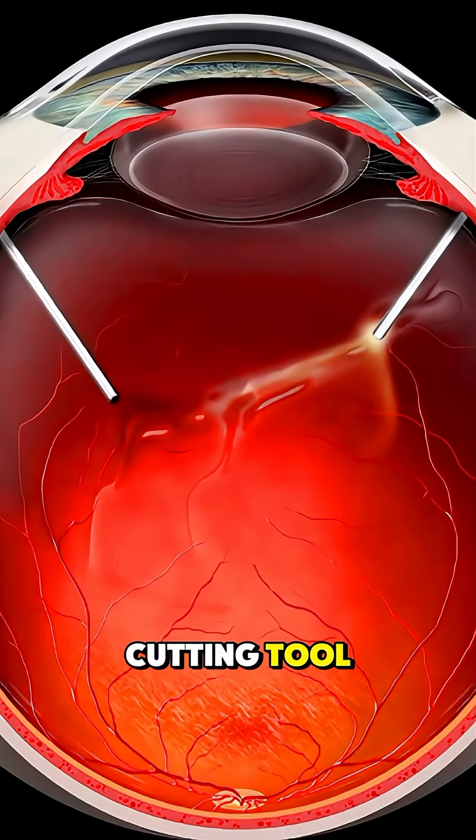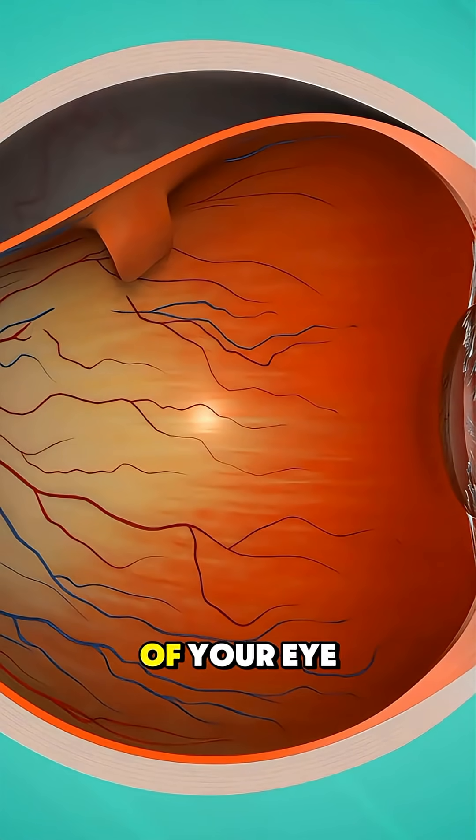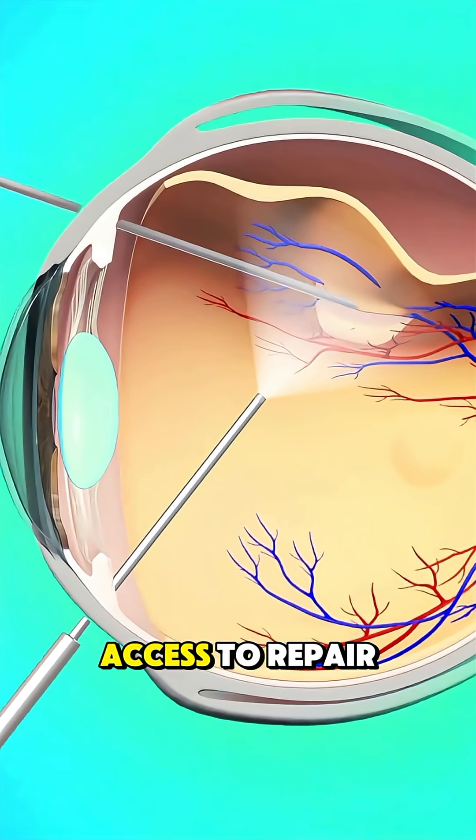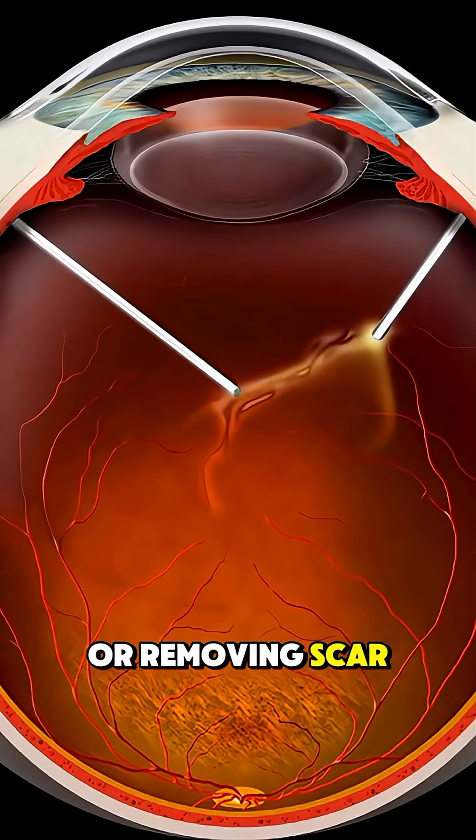The surgeon then uses a small cutting tool to remove the vitreous gel, which is the clear, jelly-like substance filling the center of your eye. This gives better access to repair any issues, such as sealing retinal tears with a laser or removing scar tissue.